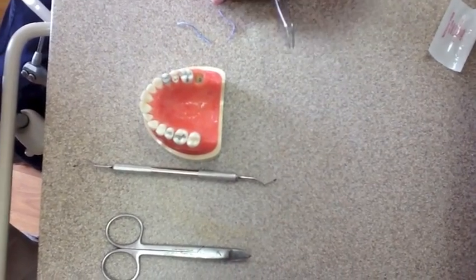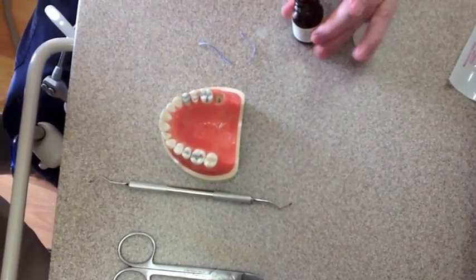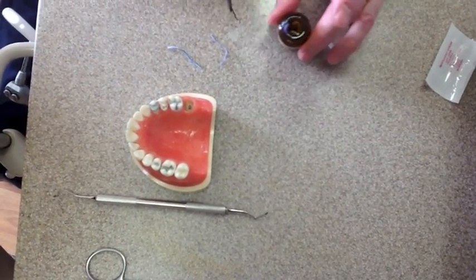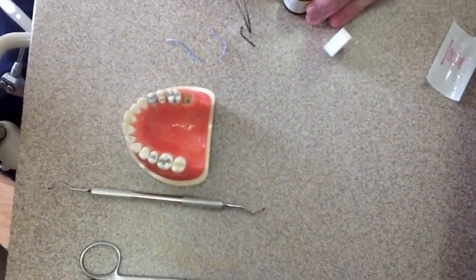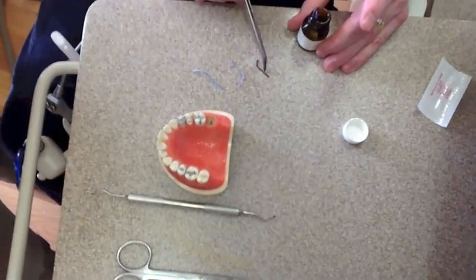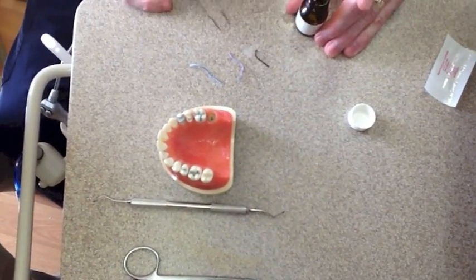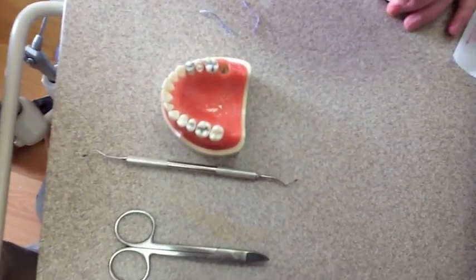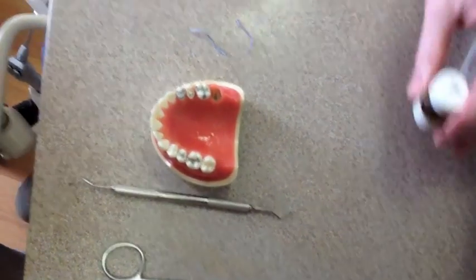So let me open this up. If you do anterior, canines are forward, then we have another color, black. Okay, so black we'll use for anterior. So an anterior tooth will go black and purple. Posterior tooth will go purple and then blue. Okay, they're just different thicknesses.